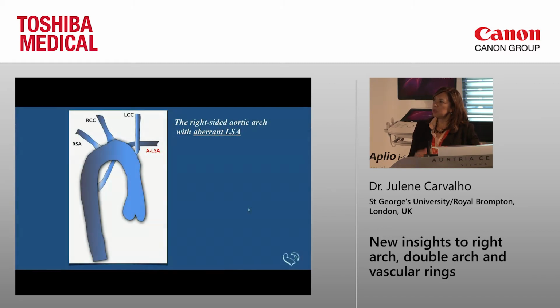So getting your orientation is very important, because when you're scanning upwards, you need to see, am I on the right or the left side? Which arm am I looking for?